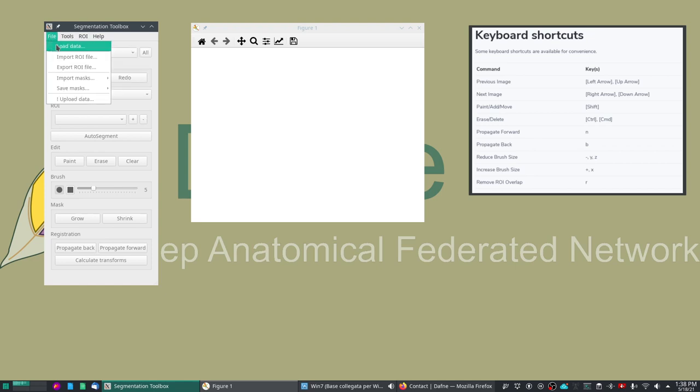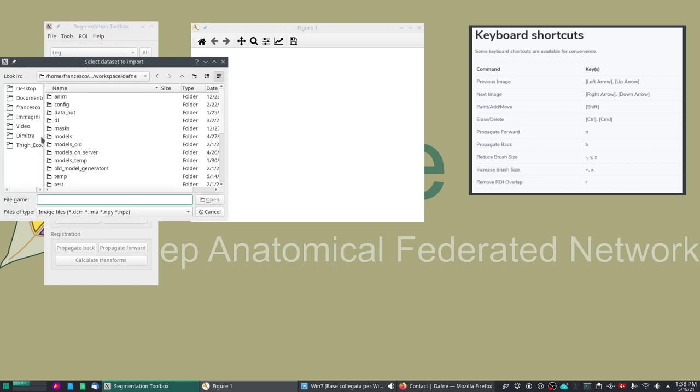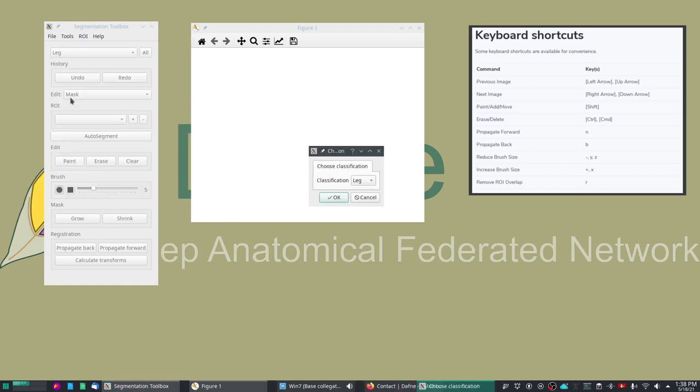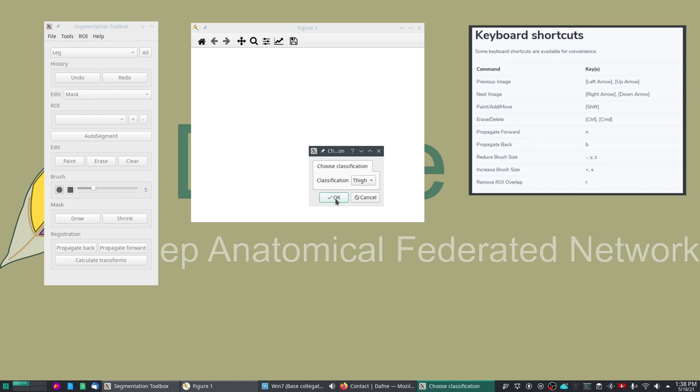So we'll start by loading data and we will start with the thigh dataset. As I mentioned we have the models for the segmentation of the thigh and of the leg. These datasets are available on the Daphne website as well in the demo page.